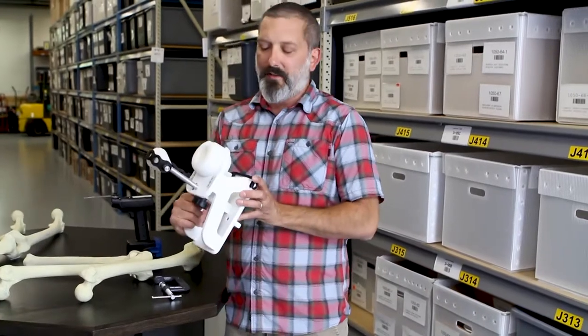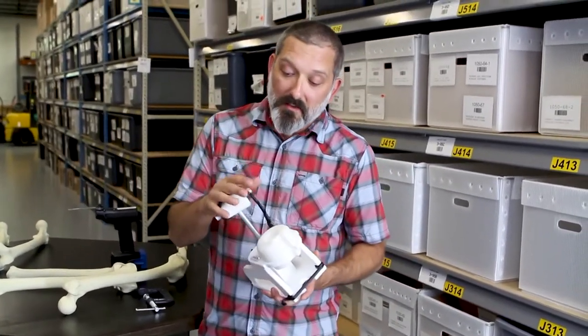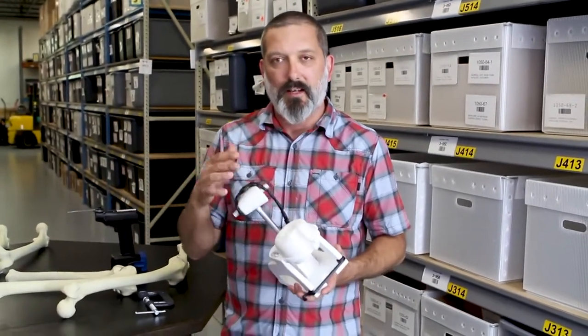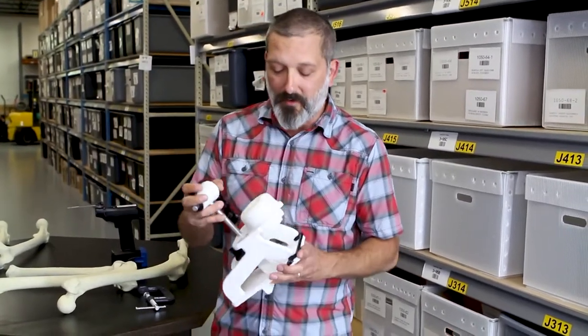The key attributes of this product are that it will work with large knees, medium knees, right knees, left knees, and various other knee systems that are custom and customer-specific that we have in our catalog.